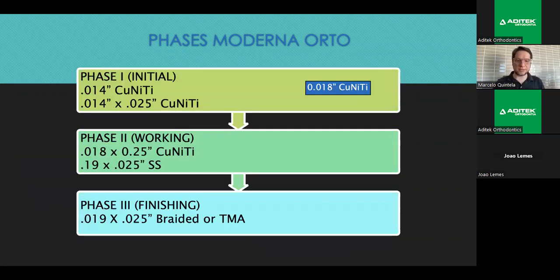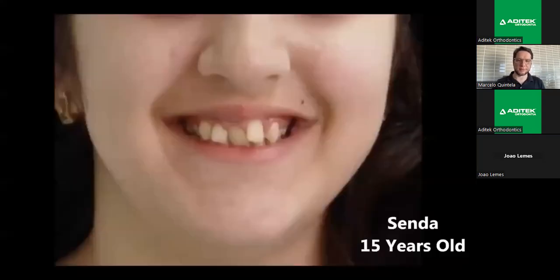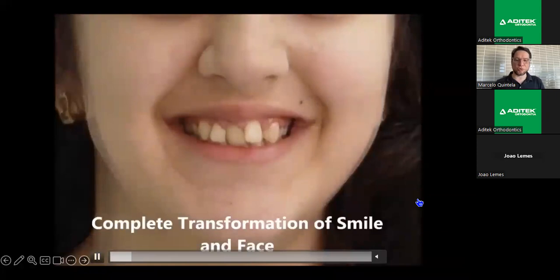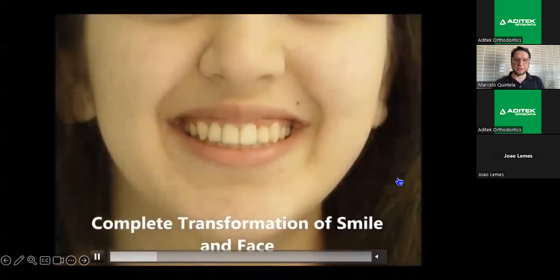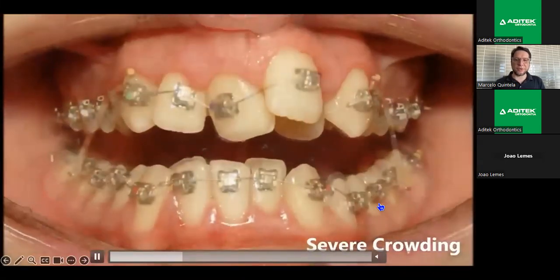Well, in phase 3, the finishing, we use braided steel to use elastics of intercuspidation. This video can show us a complete transformation of smile and face. Look at that. It's a severe crowding.